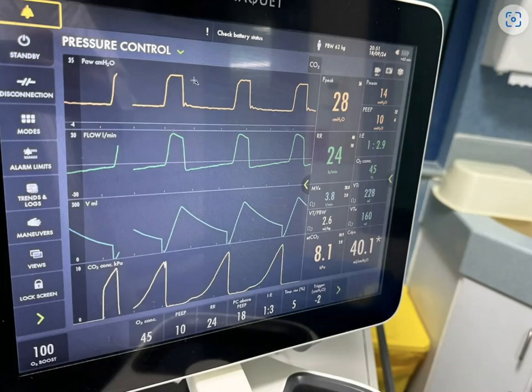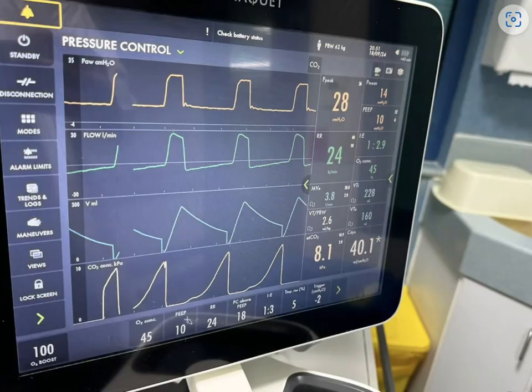Let's do this together — pressure control mode of ventilation. Pressure is set at 18 centimeters of water above the PEEP level of 10 centimeters of water. We'll be looking at pressure over time, flow over time, volume over time, and the end-tidal CO2 monitor.